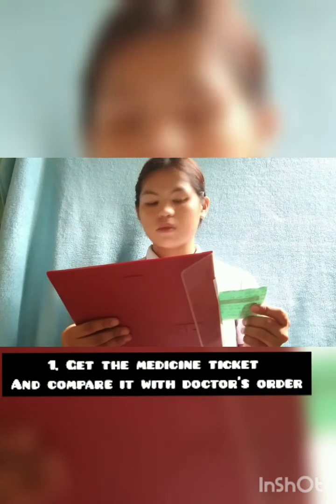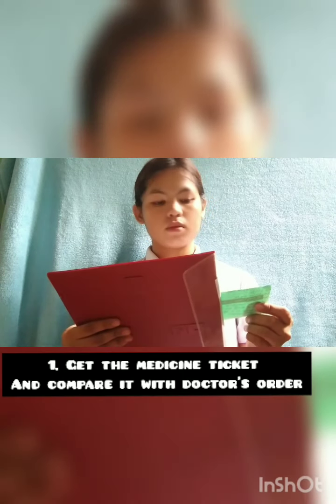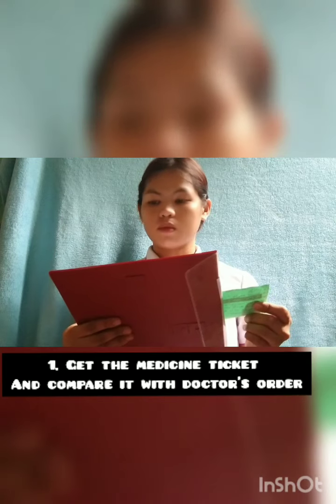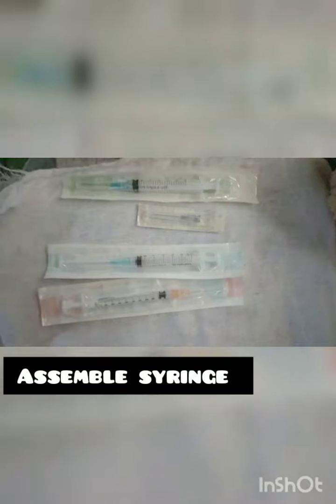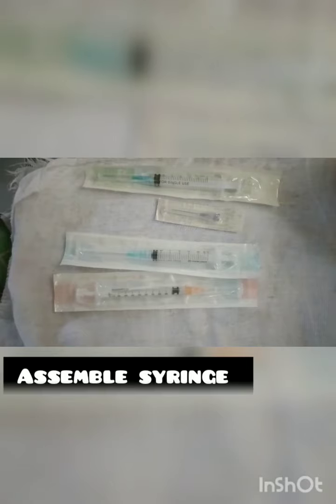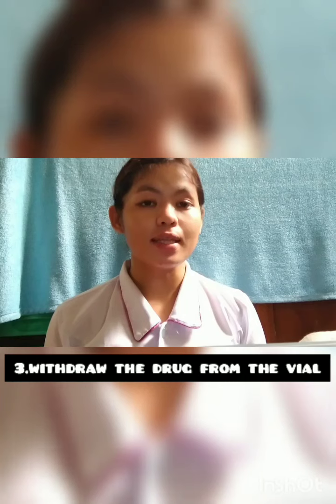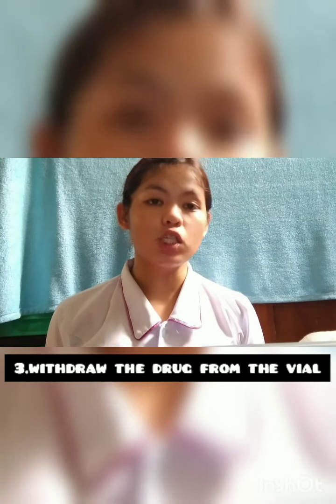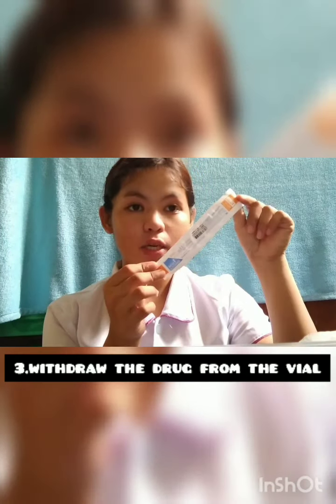Get the medicine ticket and compare it with the doctor's order. It is to ensure that the client receives the right medication at the right time. Wash hands. It is to deter the spread of microorganisms. Assemble the syringes that we are going to use. Withdraw the drug from the vial into the syringe using the aspirating needle and replace the aspirating needle with the injecting needle after. So I am using this 1 cc syringe.